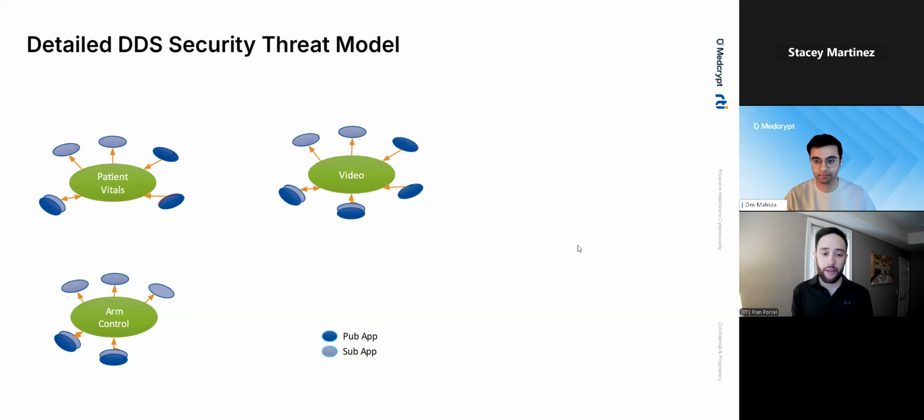We have it here in this device. This could be different sizes of network, or different hosts on the network, could all be on the same host. Good thing is that with Connext, that doesn't really matter. This is a global shared data space, a Connext data bus, where the applications can communicate whether they're on the same device or on different devices. But we have 3 different topics.